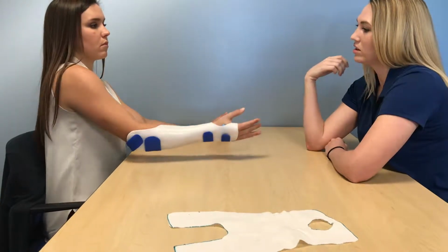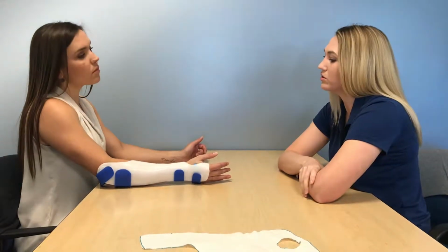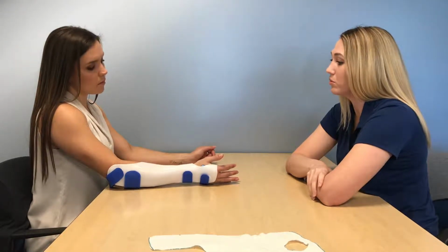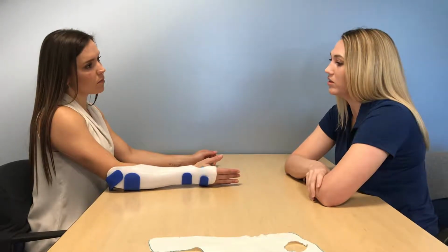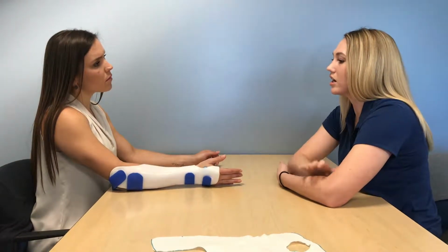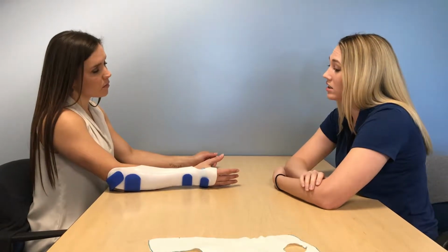Great. So now when wearing this at home, Kylie, you're going to want to clean it every day, so just use disinfected wipes. Try not to leave it in the car. Any type of heat can actually morph the material, which we would have to remold then. If at any time you feel discomfort or that it's rubbing against you, please call me and we will make any adjustments that are needed.